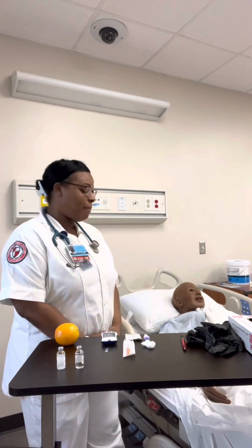My name is Ambrielle. In this video, I'll be demonstrating glucose measuring and mixing and administering insulin. First, I'm going to start by verifying my physician's orders and identifying my patient. Performing hand hygiene, donning clean gloves.